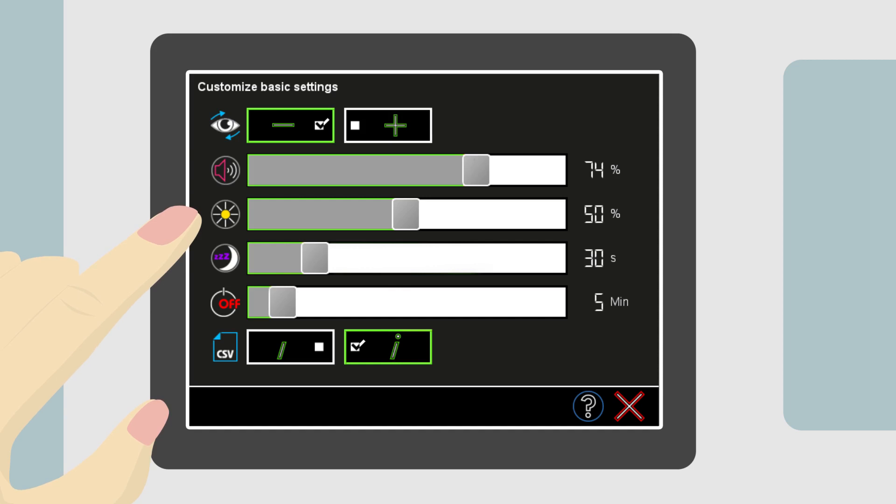Under the volume settings is the brightness of the screen adjustment, followed by the screensaver timer. The device will arrive with a default setting of 30 seconds. This means that the screen will go blank after 30 seconds of non-use.